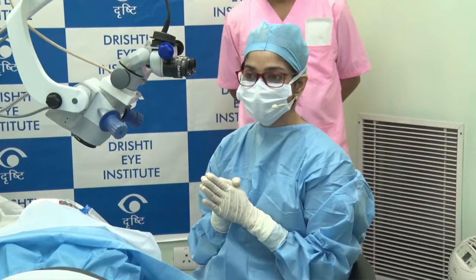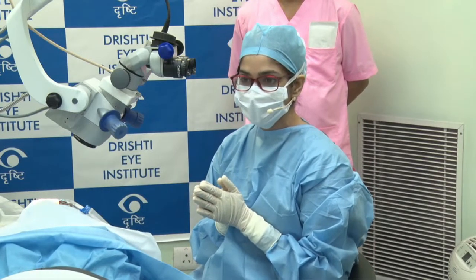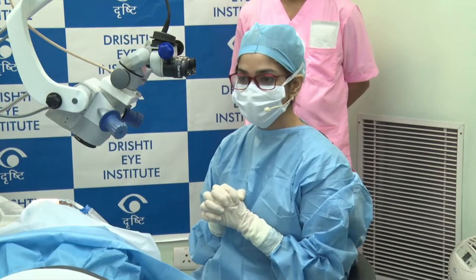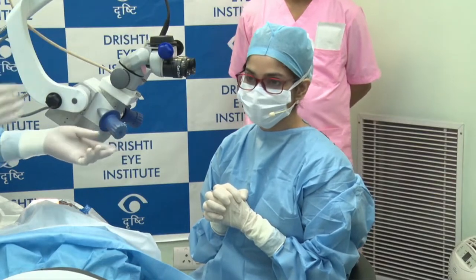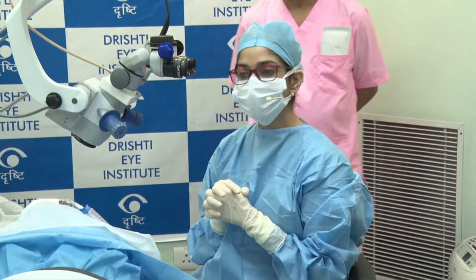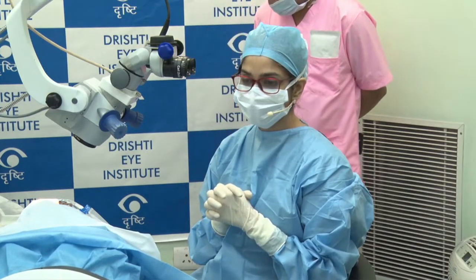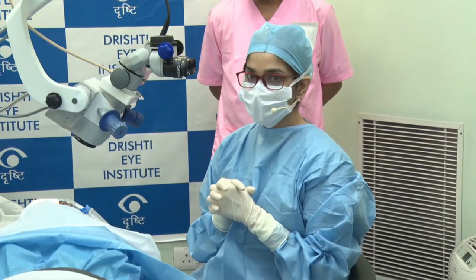From time to time, it's a good idea to do gonioscopy to see the right positioning of your stent post-operatively also. But yes, PAS is an established complication, but it's also rare at the same time. Not that the lumen gets blocked. Lumen doesn't get blocked.